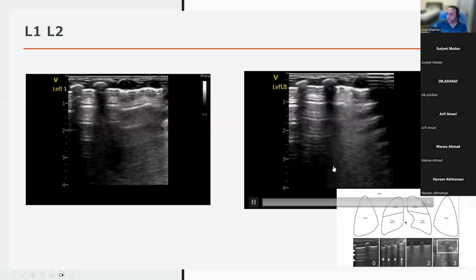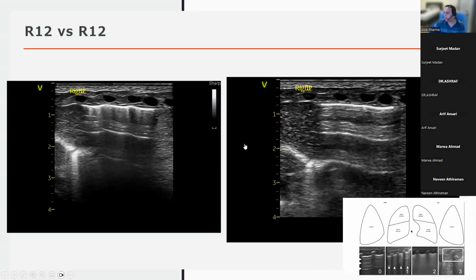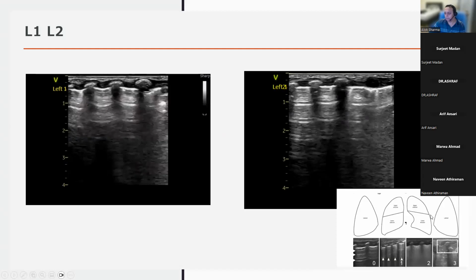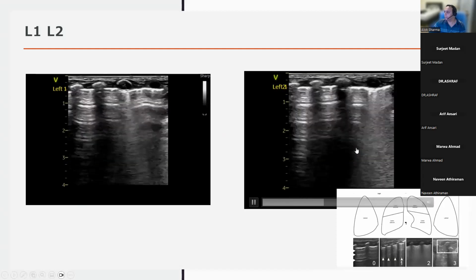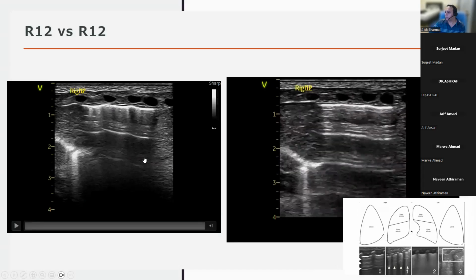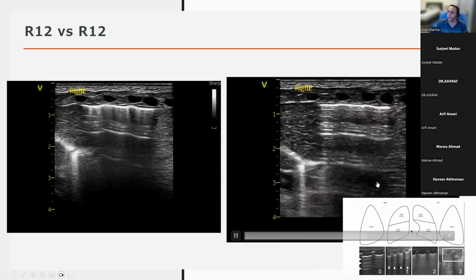Can you see how the GE over here, I'd just like to show you this image. Can you see here the image intensity? It's uniform throughout.